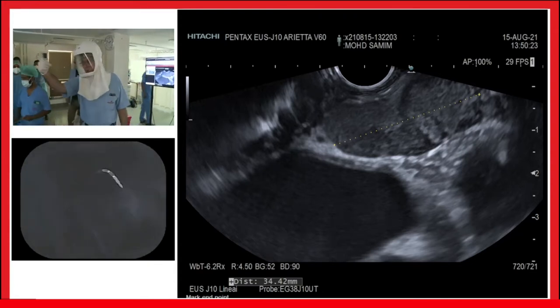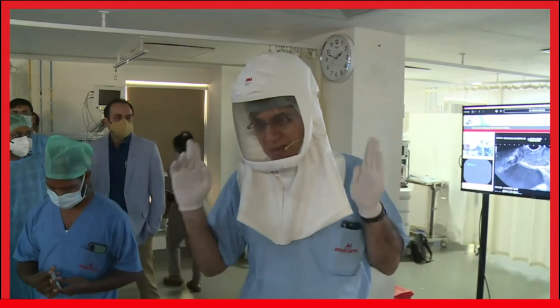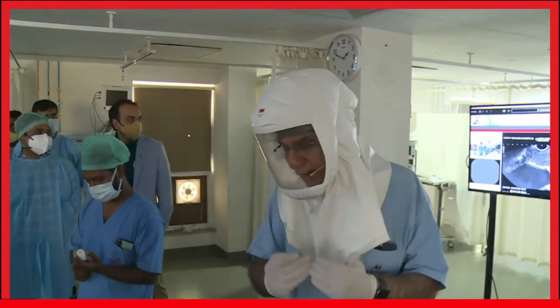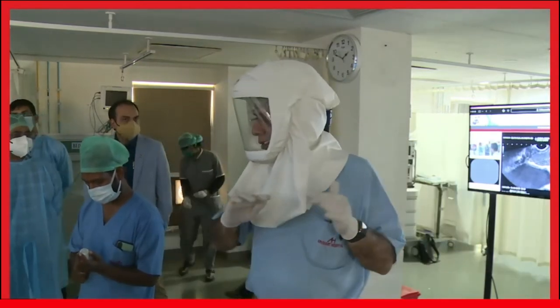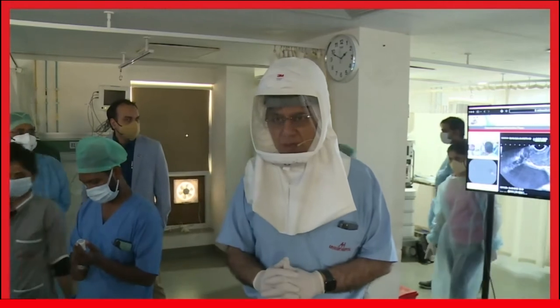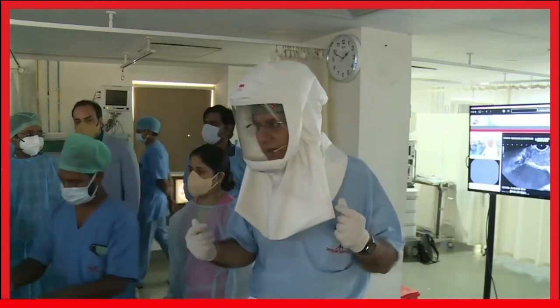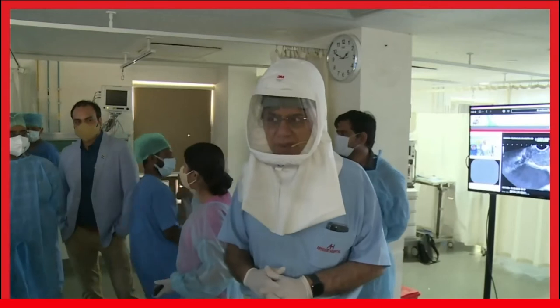Shape. Now, this particular lymph node is rounded and hypoechoic. This is more likely to be malignant. The lymph nodes, when they enlarge, tend to lose their medulla, and the hyperechoic medulla is no longer hyperechoic. And there is invasion of the tumor. So in this particular lymph node that we have seen just now: site, size, shape, then character, then vascularity, then elastography, and finally contrast injection. So we have just mentioned briefly some of the characters of the lymph node.